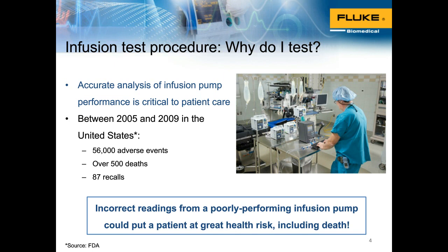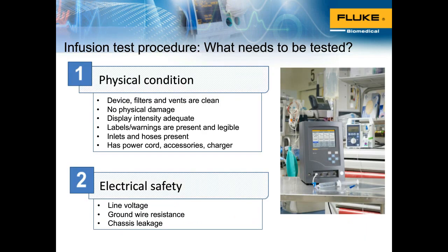We all strive every day to make sure that patients are safe, and that all the operators are safe. So it's very important to test those pumps per the guidelines issued by the manufacturer or by your organization, whichever method you use. So what is required to be tested when it comes to infusion pumps?